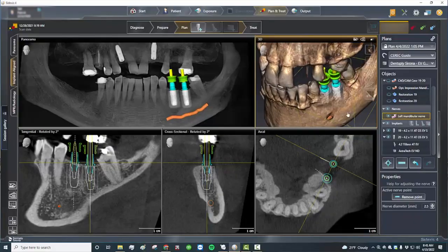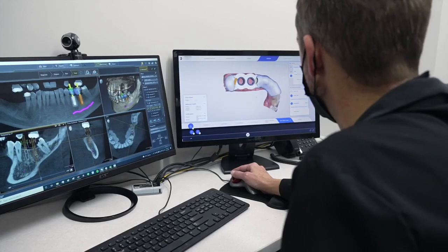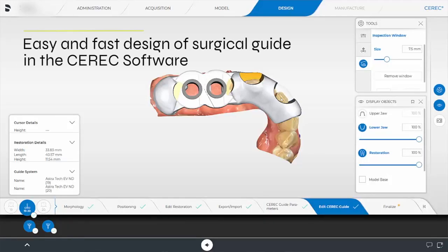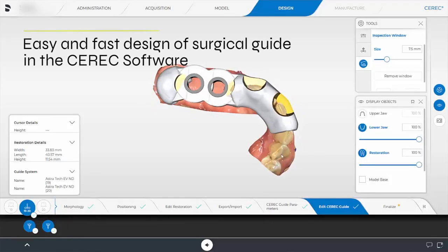Once we're done, we're going to go back to the CEREC software with this file. Now it's time to go ahead and design our surgical guide. We decide where we want the windows to be placed just to make sure that when we seat the guide, it's perfectly accurate.